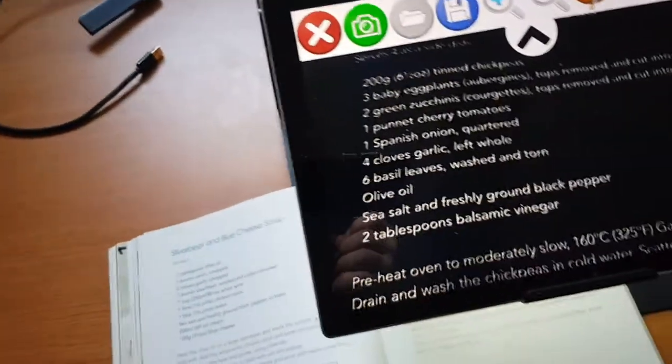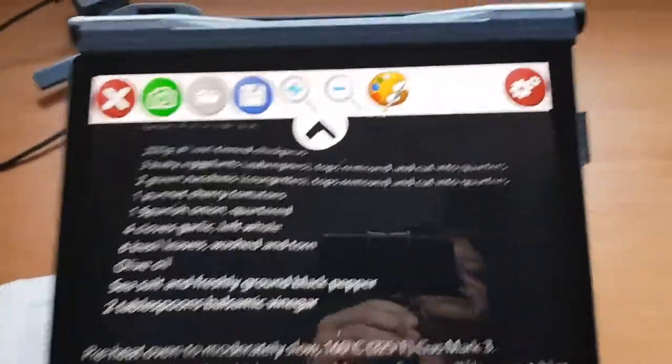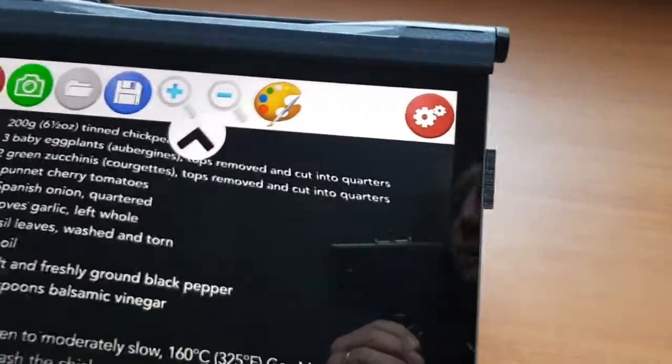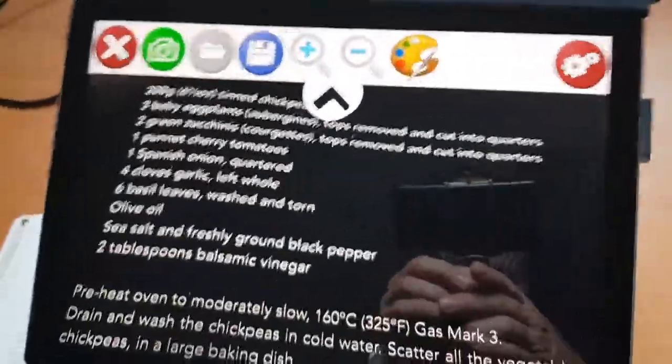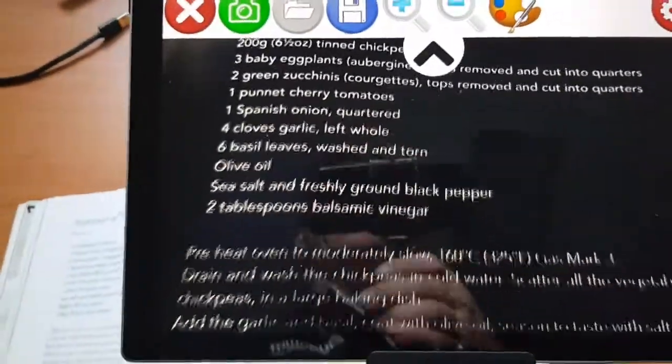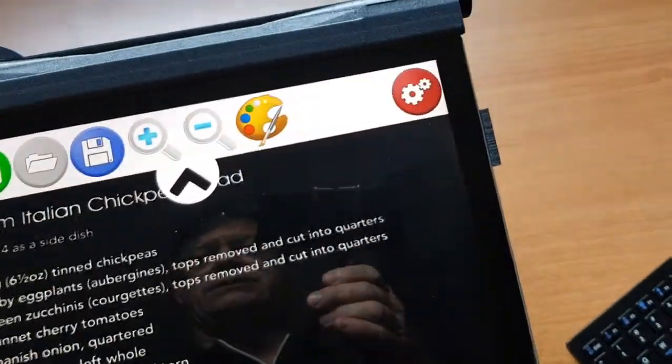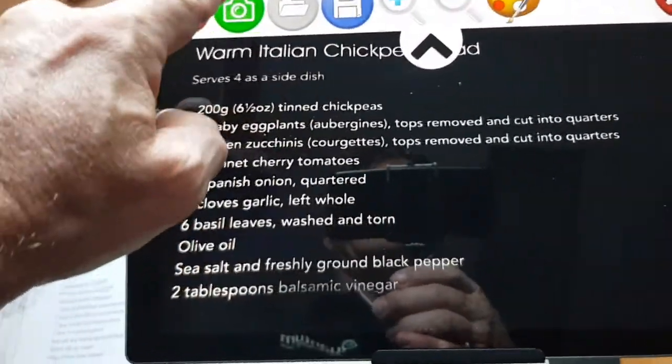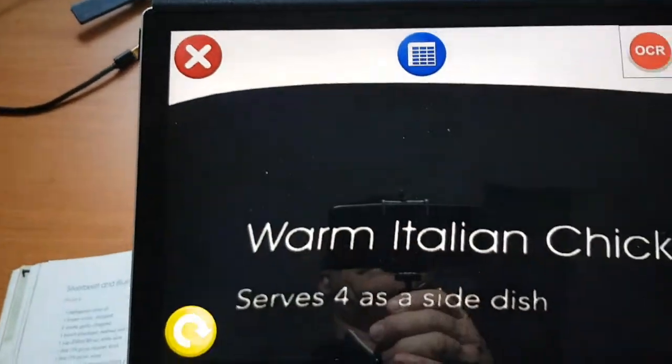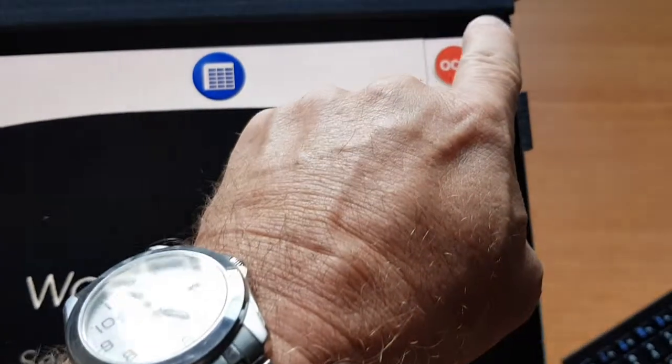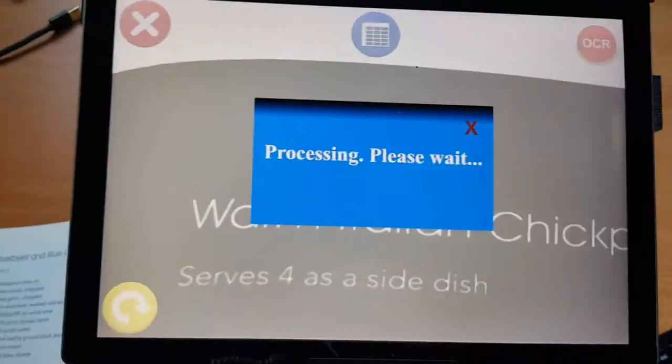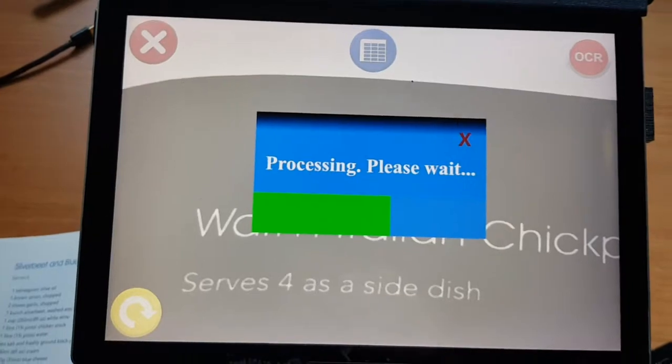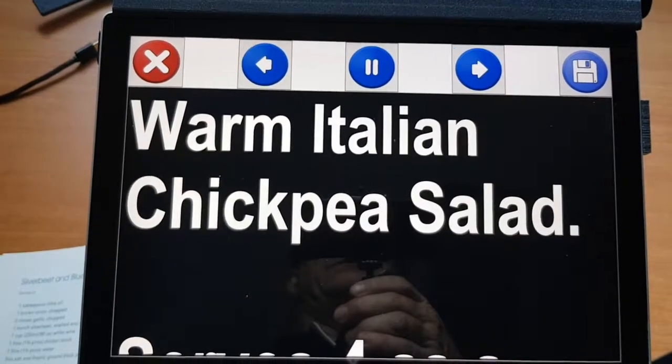In addition to this, we can actually OCR the document. Now OCR refers to the ability to capture and read out loud the text, so what we'll do is we're just going to align it a little bit here within the frame. We press the camera button here, and then there's an OCR, optical character recognition button here.